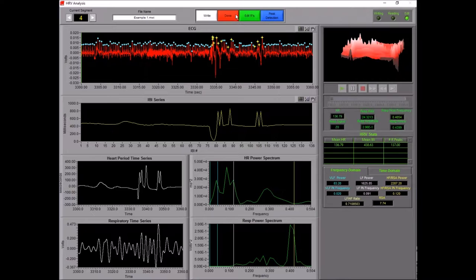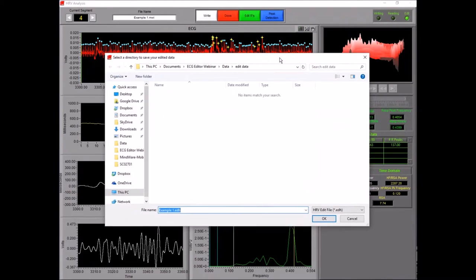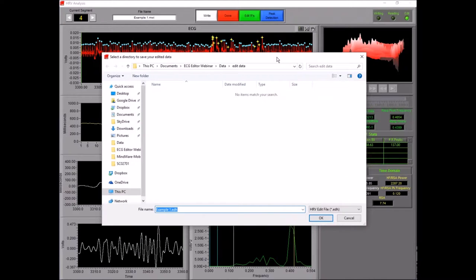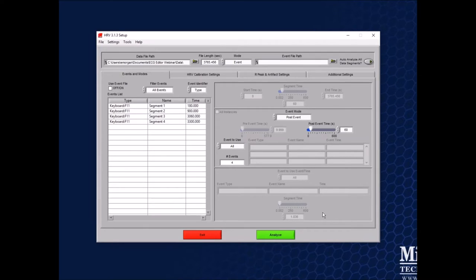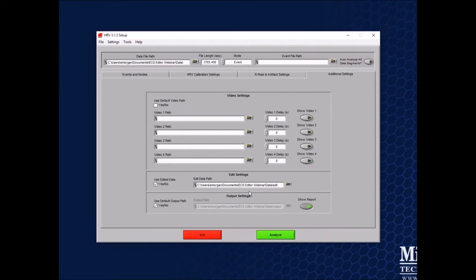Those are all the examples in this file, so I'll press Done and be prompted to save my edit data. In the MindWare applications, edits are stored in a separate file so the raw data is never altered — you can always get back to your raw data. I'll save it as example1.edh. From this moment forward, to use your edits and recall them, you need to go to the Additional Settings tab and select that edit file in the Edit Settings section. If you close and reopen the file, that field will be empty and you'd have to reselect the edit file.